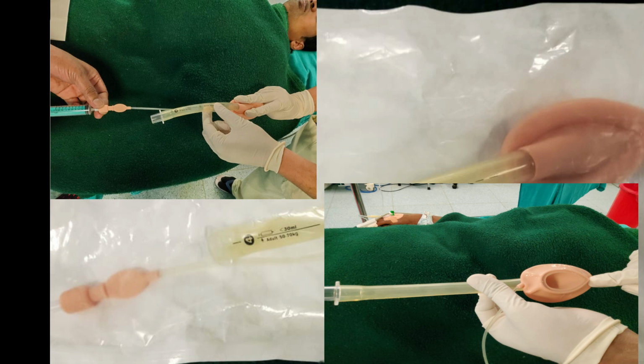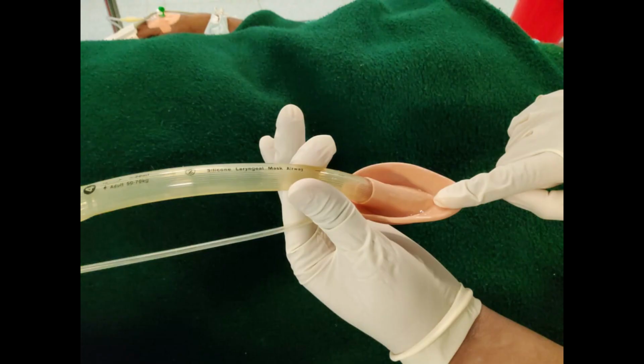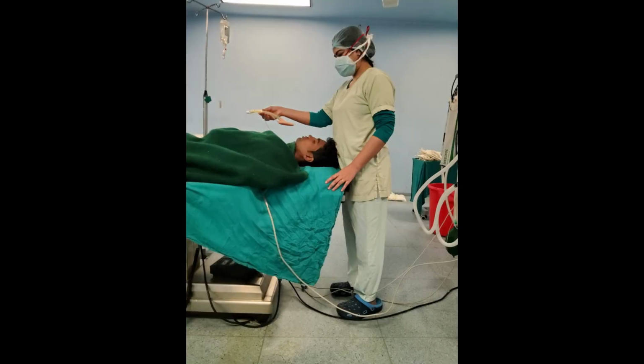Pre-insertion, we inflate the pilot balloon and see whether the cuff is inflatable or not. Inspect for any cuts, blockage, or indentation in the interior of the airway. Check whether kinking of the tube is present or not. We apply the water-soluble lubricant jelly, for example KY jelly, on the posterior surface before the insertion.